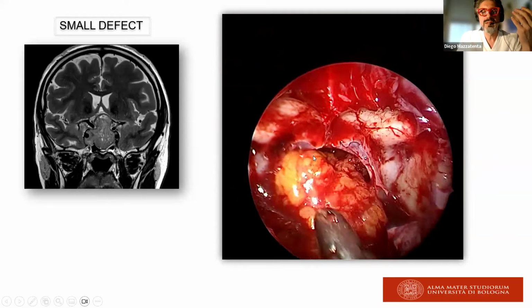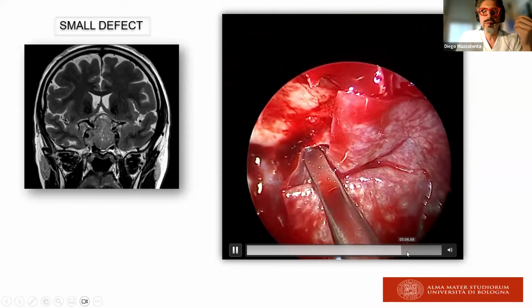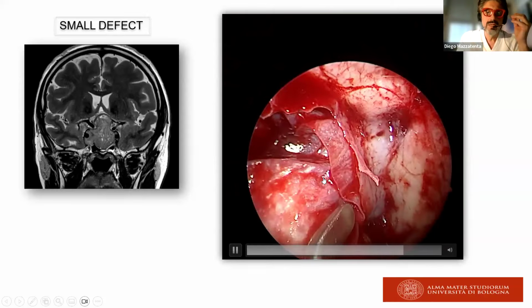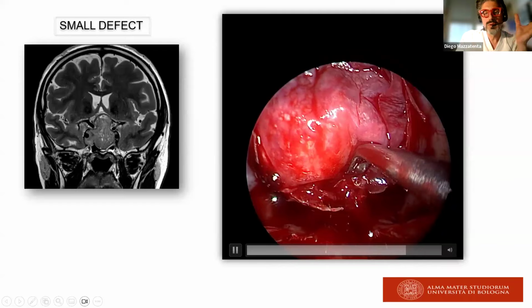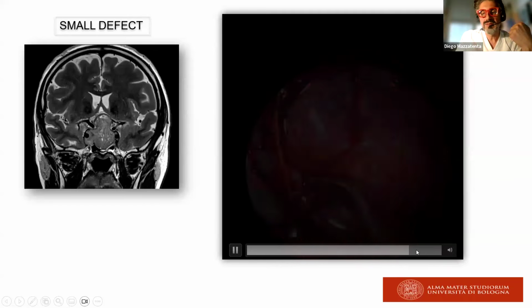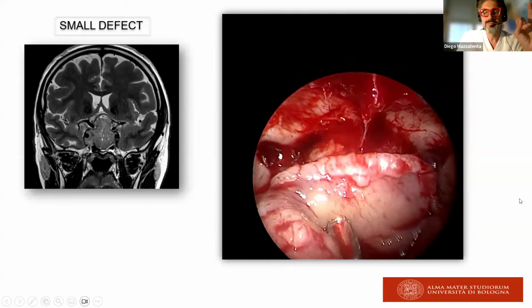We put fat inside our surgical field, and after we cover, we also use heterologous material, the Biodesign, but the principle, this is a mechanical system to pull out the fat, and after we close with a free flap and not a pedicle flap.